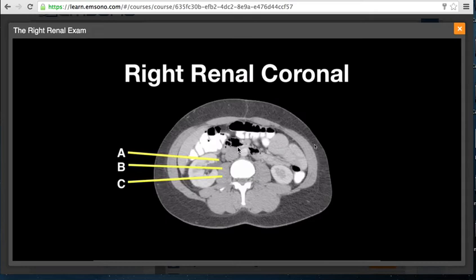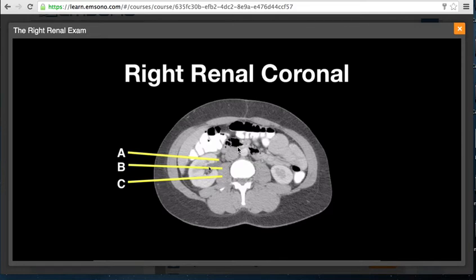Since the goal of this study is to detect hydronephrosis, it's essential to identify the renal pelvis when scanning the kidney. If you scan in plane A or plane C, you would still see the renal parenchyma, but the renal pelvis would be missed and hydronephrosis would be easily overlooked. Ideally, you want to scan through plane B, which passes through the renal pelvis and allows you to diagnose the presence or absence of hydronephrosis.